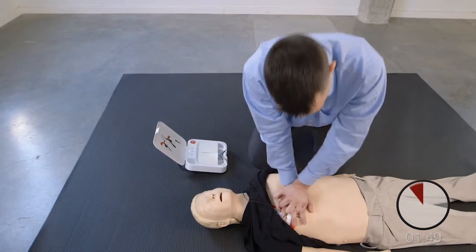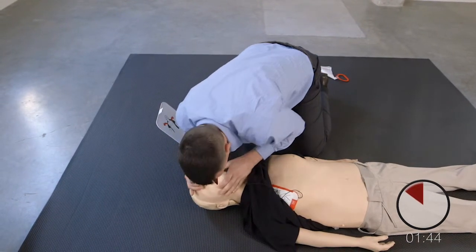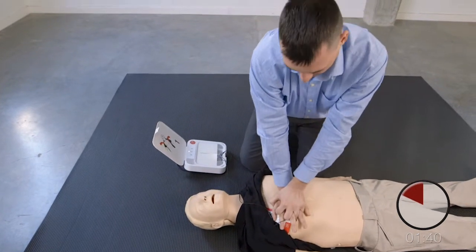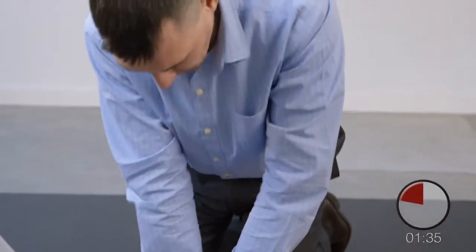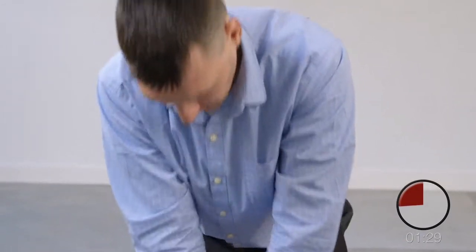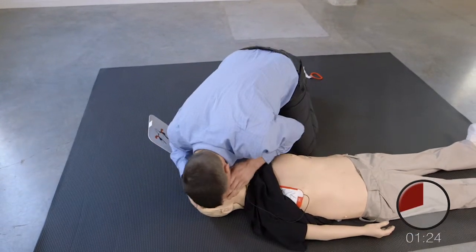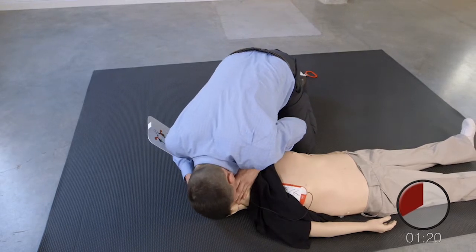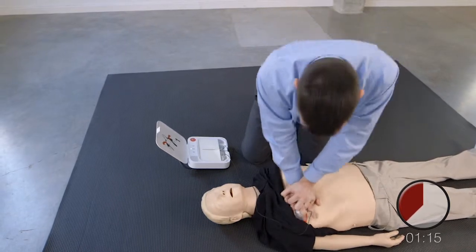Push down hard at least 5 centimetres. Provide two breaths. 1, 2. Resume chest compressions. Push down hard at least 5 centimetres. Provide two breaths. 1, 2. Resume chest compressions.